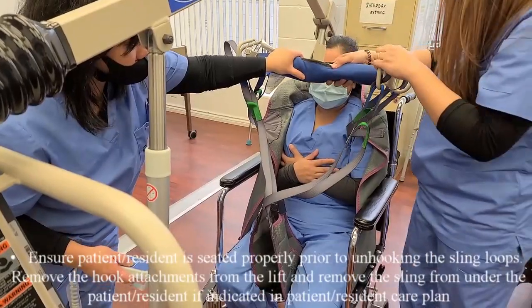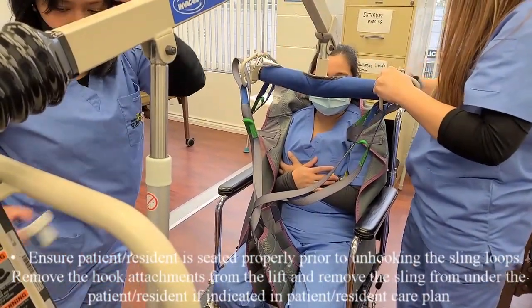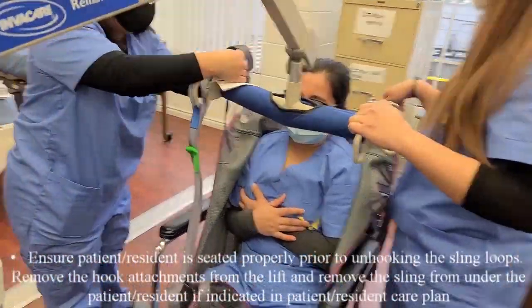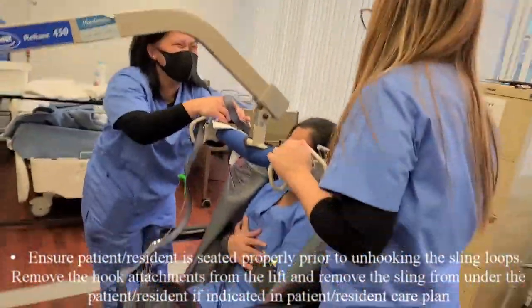Ensure the resident is seated properly prior to unhooking the sling loops. Remove the hook attachments from the lift and remove the sling from under the resident if indicated in the resident care plan.